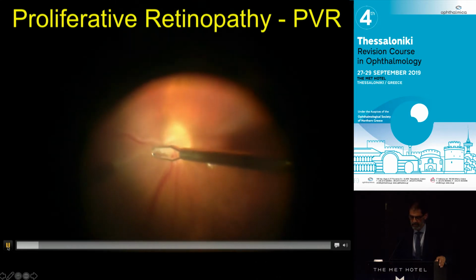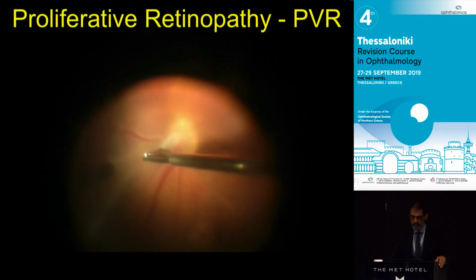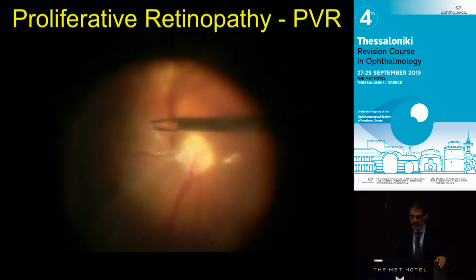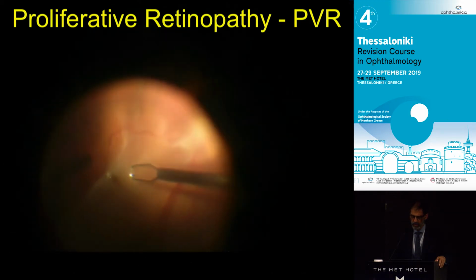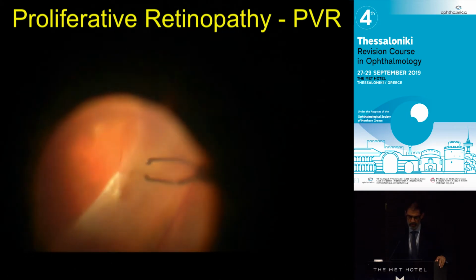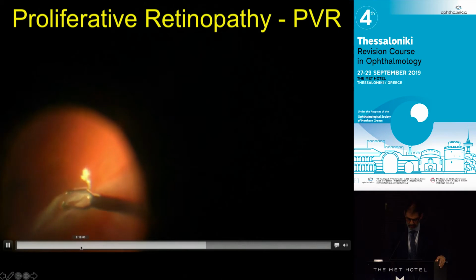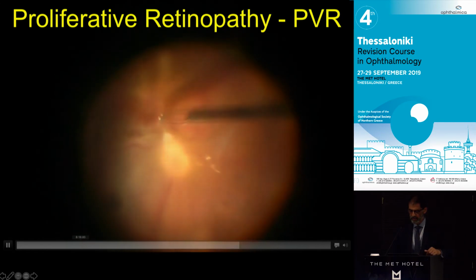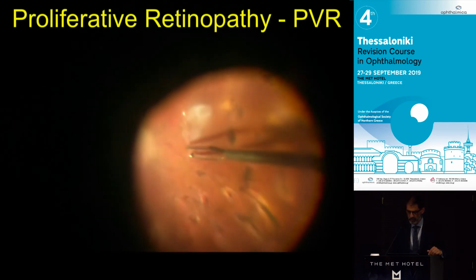You get these very tough membranes, and you'll see what happens here is that the adherence is very clear because the retina moves a lot as you're trying to peel them. It comes off in big sheets. Some of it is residual vitreous cortex, and some of it is primary new retinal fibrosis in terms of reaction, and this peels off usually very nicely until you get to the old vitreous base. You can see the strength of the traction here. It's made this very big fold, and we're folding and peeling up here. So these peel away, and eventually when you peel away, you relieve the traction, sometimes requiring a retinectomy, and then you're able to reattach that retina and usually put silicone oil to hold it there for a lot longer.